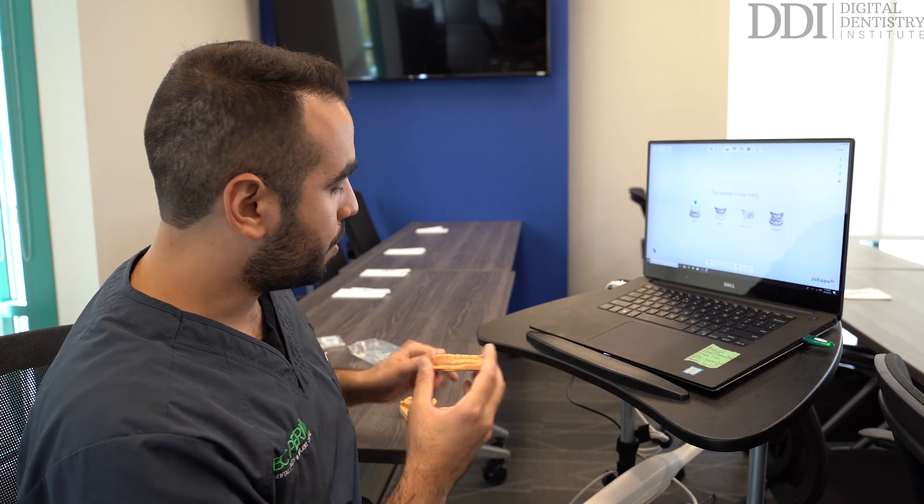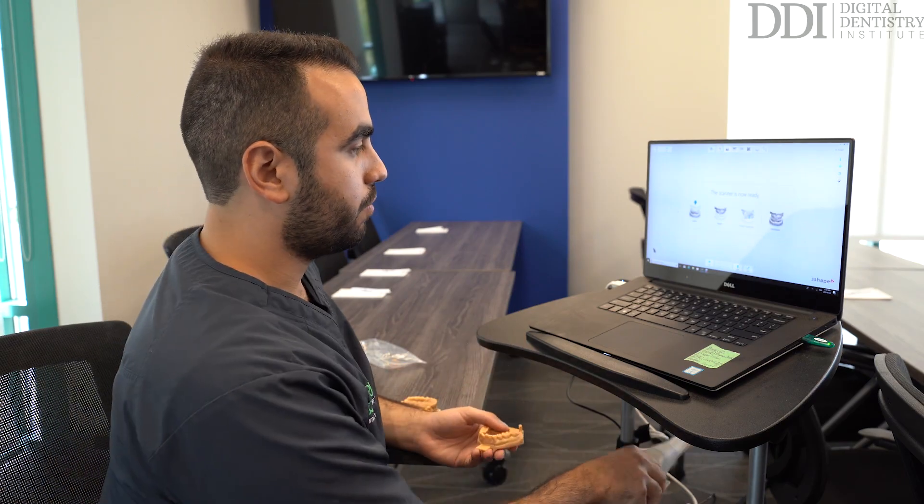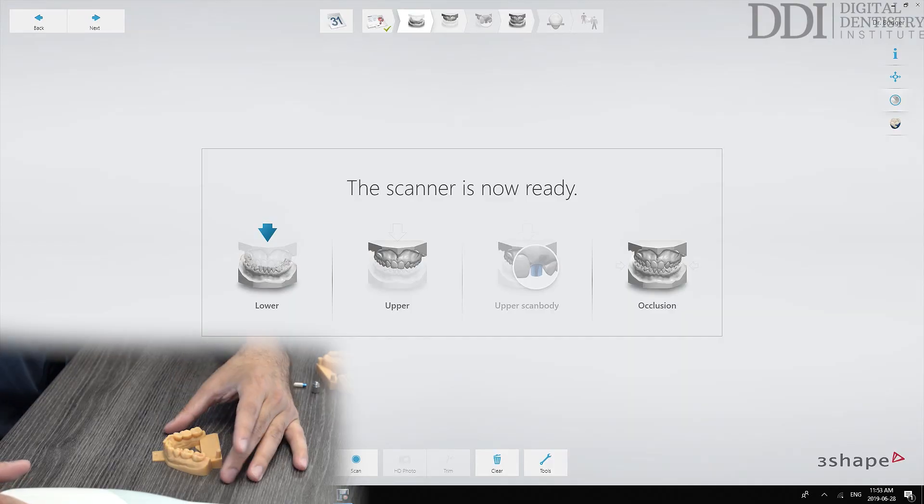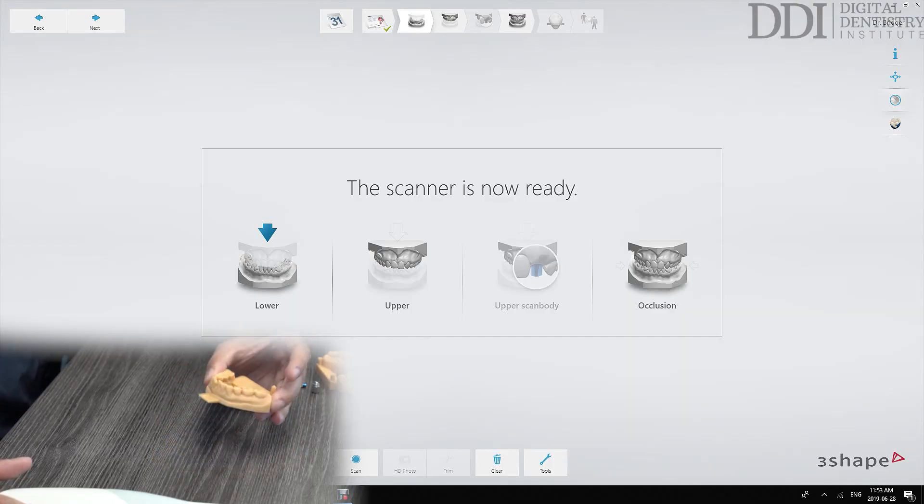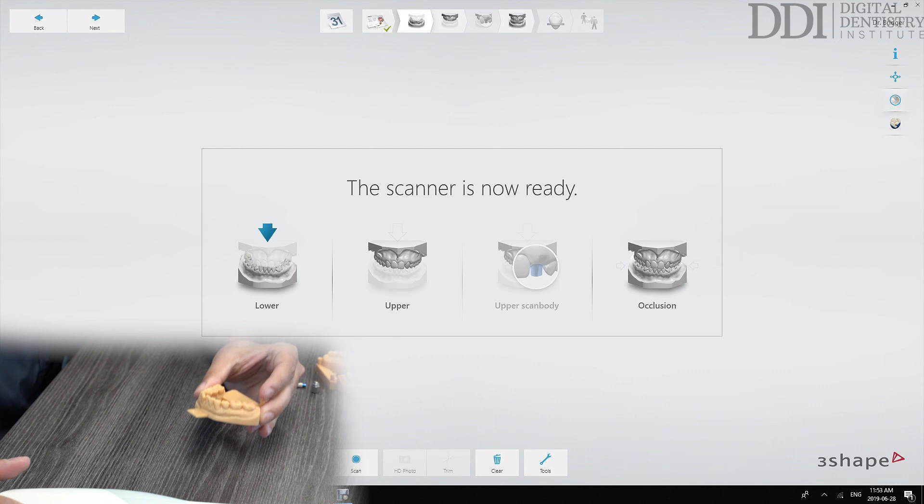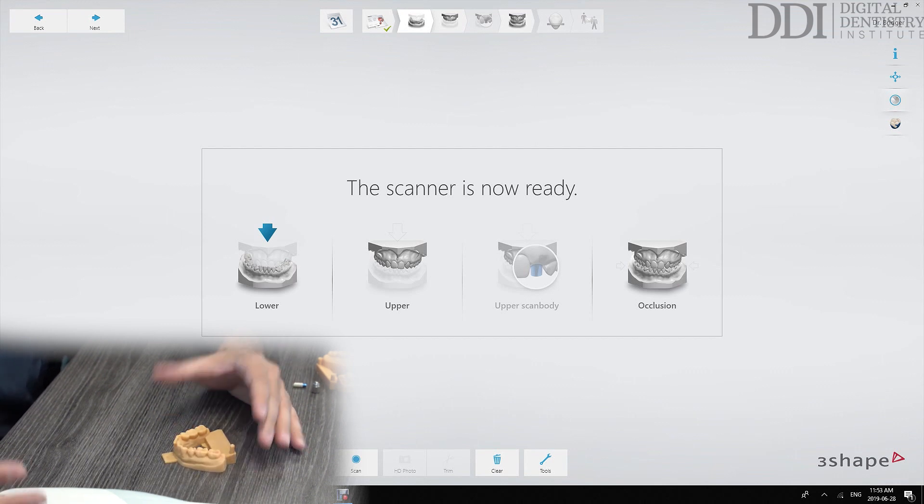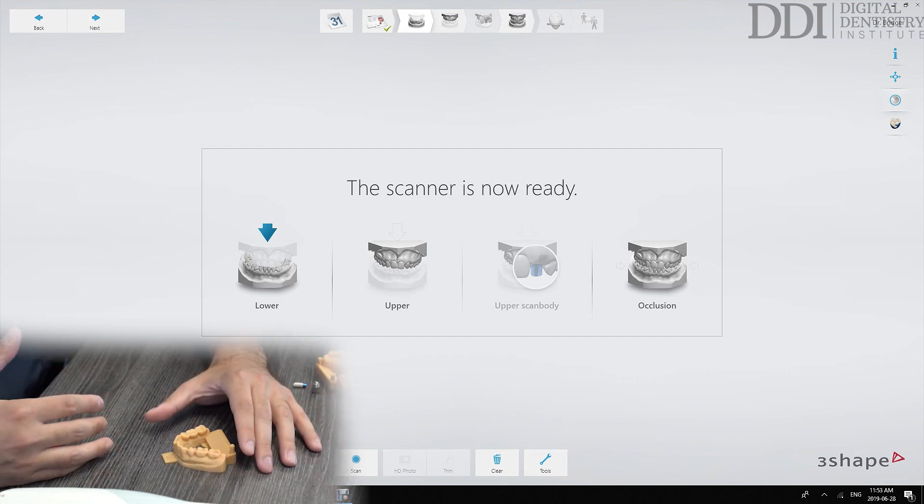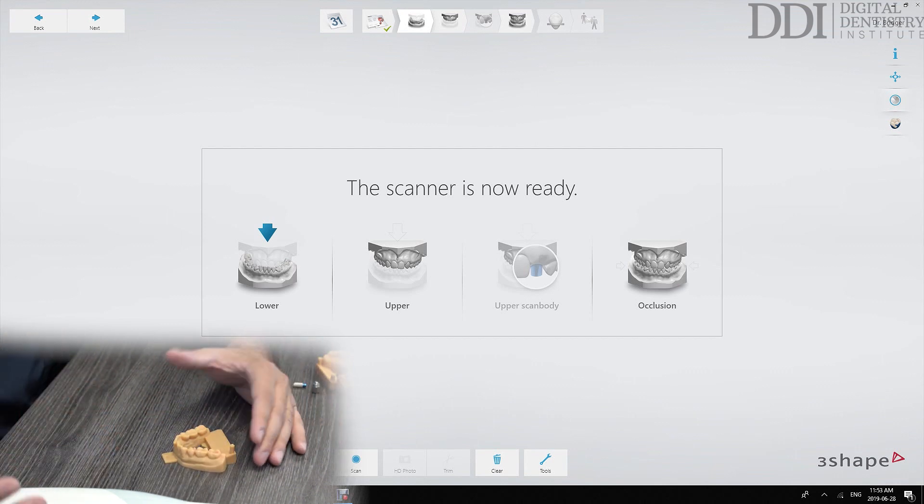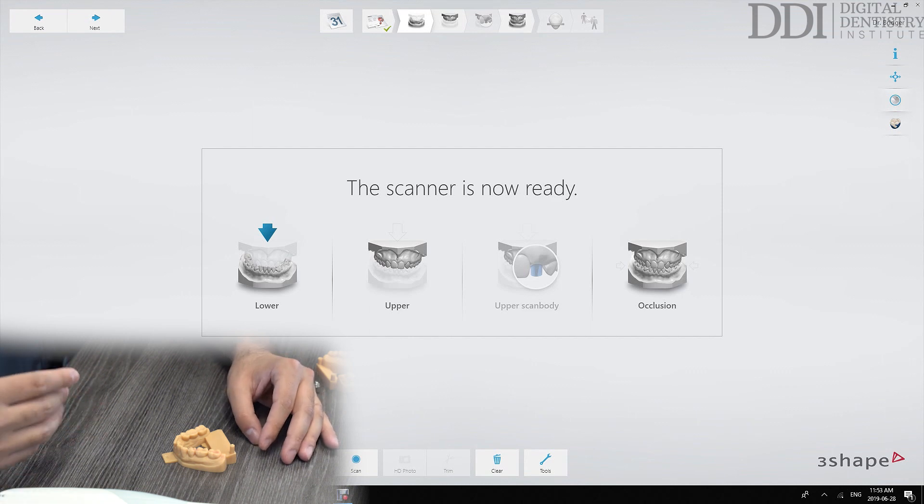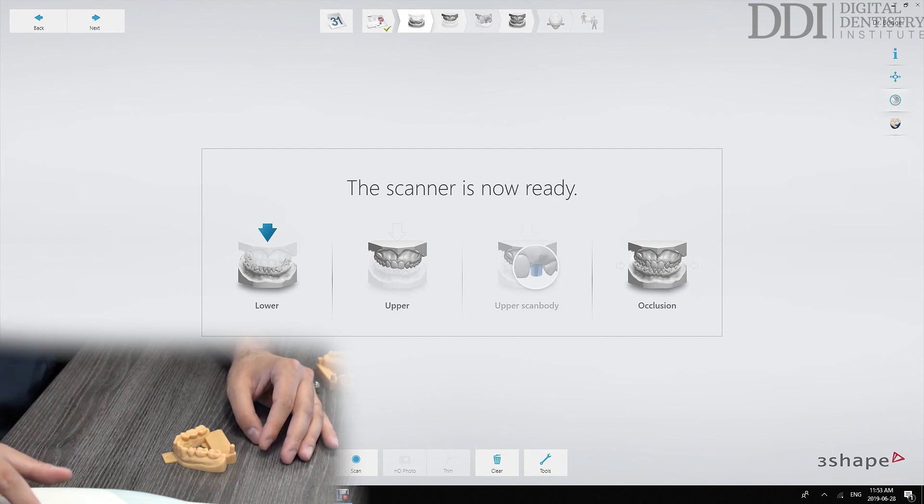So let's start with this lower scan. At this point we're going to take the opposing quadrant impression. Whether we're taking an impression for study models or for an opposing model or for the actual indication itself, there are certain guidelines we can follow that will make that scan more predictable.